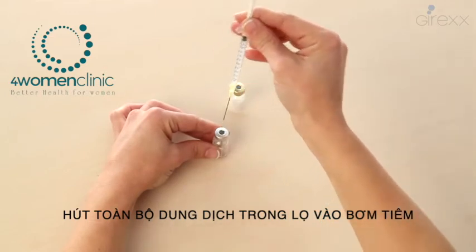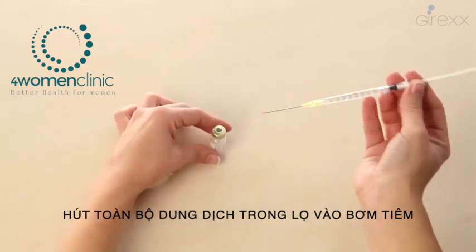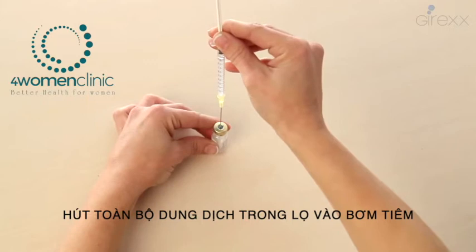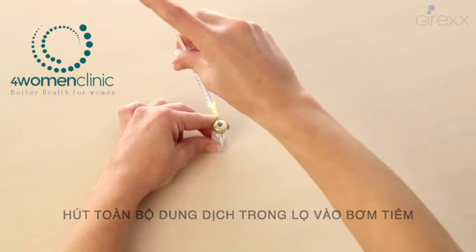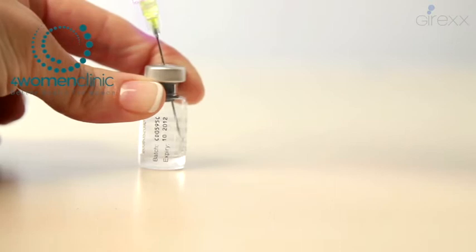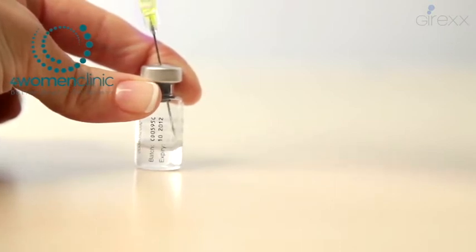Hold the vial firmly and, holding the syringe like a pen without pressing the plunger, introduce the needle vertically into the centre of the rubber cap. Gently press the plunger to introduce all the liquid — remember to do it slowly to prevent foam formation.